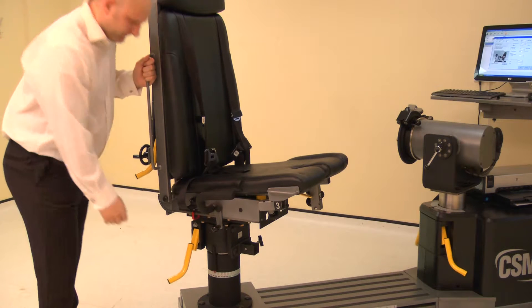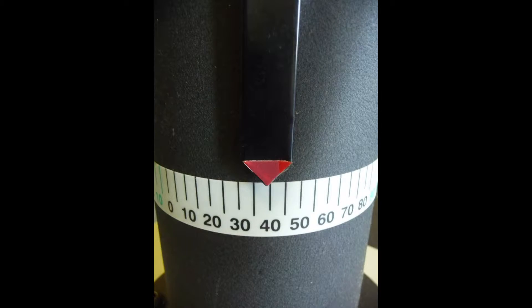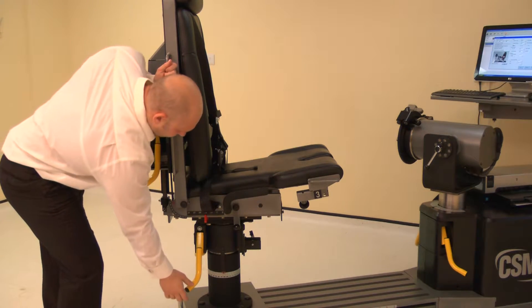Now adjust the chair rotation. Lift the locking handle and rotate the chair to 40 degrees on the black scale. Ensure both locking handles are pushed down to secure.